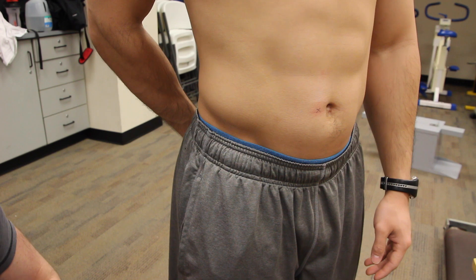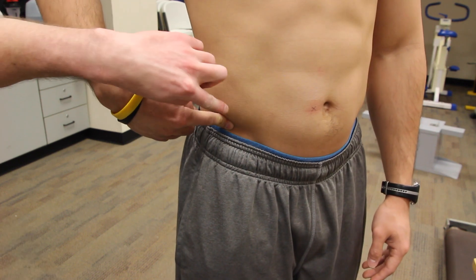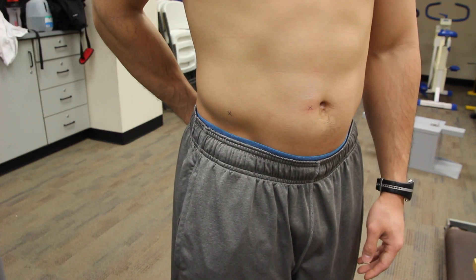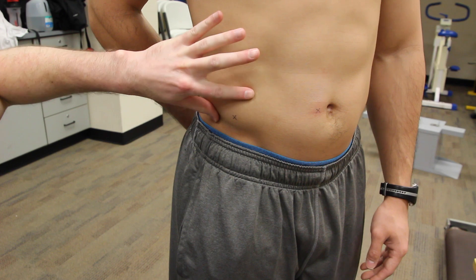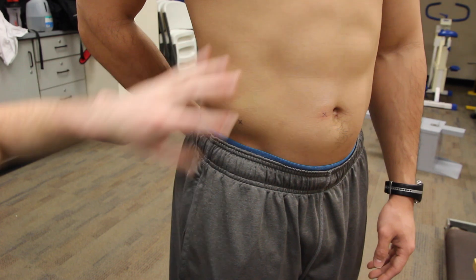For the suprailiac site, have the client indicate their hip bone. Come immediately superior to that to mark your X. Come in with a diagonal fold to obtain your reading and release.